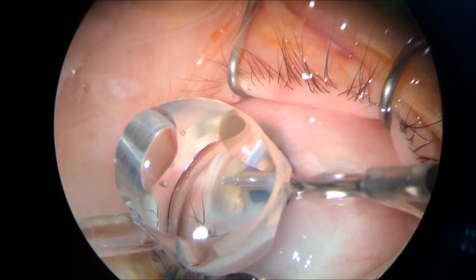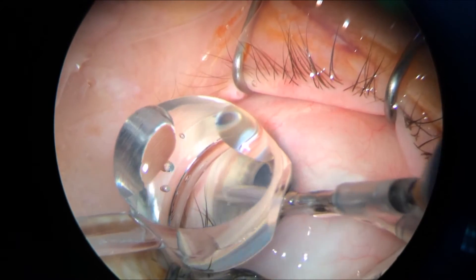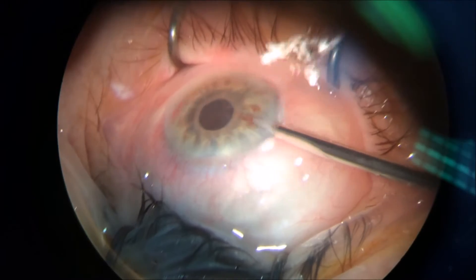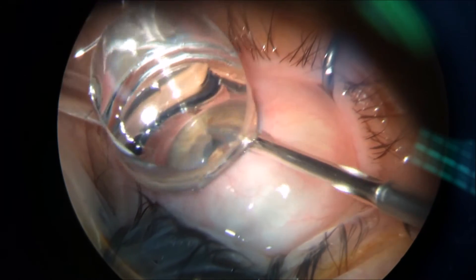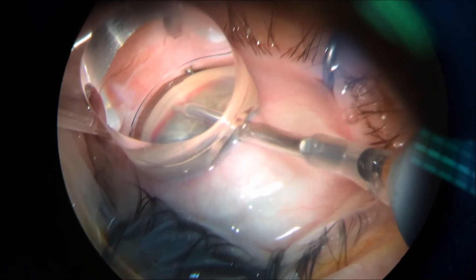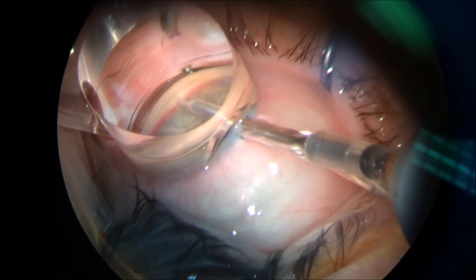In this case I used the 23-gauge vitreocutter and the irrigation for that vitreocutter for the anterior chamber. I intentionally got out of the eye and brought the pressure gradient low, so I got the hypotony.